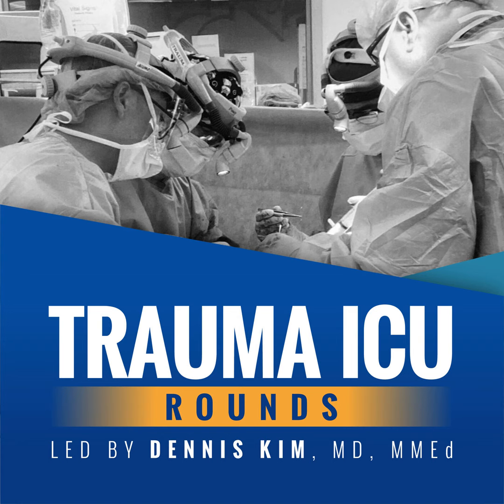In terms of the targeted control variable, again, when we think about the respiratory equation of motion, the key variables there are pressure, volume, and flow that we can independently manipulate when we place patients on the ventilator. By far, the two most common target control variables are going to be volume and pressure. So volume control ventilation or pressure control ventilation. In the next episode, we'll do a deeper dive into what differentiates volume from pressure control, and we'll also go into some of the advantages and disadvantages of these two target control variables.